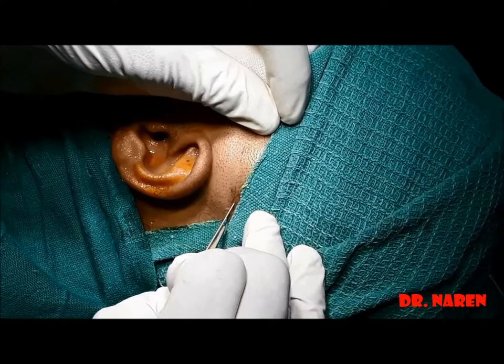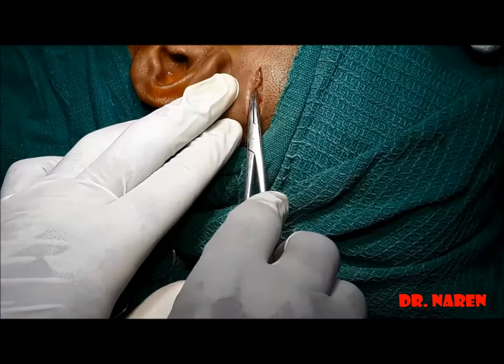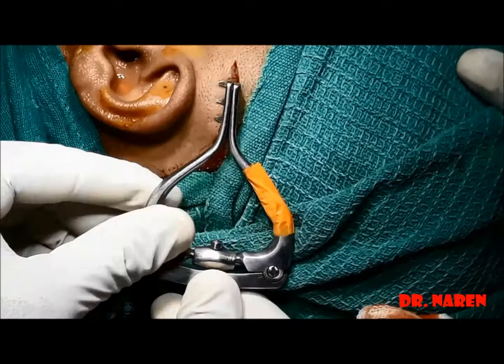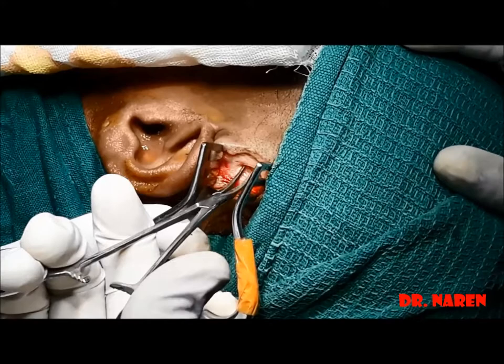Infiltration is given, after which a horizontal two centimeter incision is made just 0.5 to one centimeter superior to the helix. We are using the mosquito forceps, just dissecting the next layer which is the subcutaneous tissue. Using the Jensen self-retaining retractor, we are retracting the deeper layers. We can use small retractors as well for this purpose.